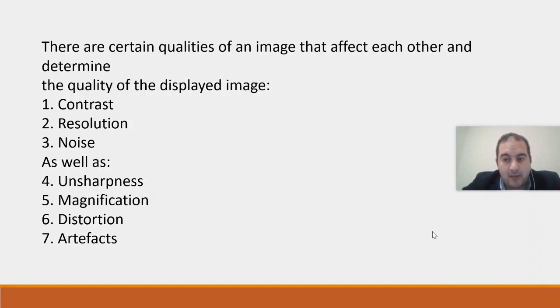When you set up the machine, you apply the existing protocols and then assess whether the machine is functioning correctly, ensuring that all parameters are optimized for the best possible outcome. Ultimately, this is a decision for the radiologist, and whether the image meets the necessary criteria will determine if adjustments to the parameters are needed to achieve a diagnostic image with the lowest possible dose, ensuring patient safety and image accuracy. I have a range I can work within, and the matter depends on the experience of the medical physicist and whether I have practical experience or with the technologist in setting the existing protocols.